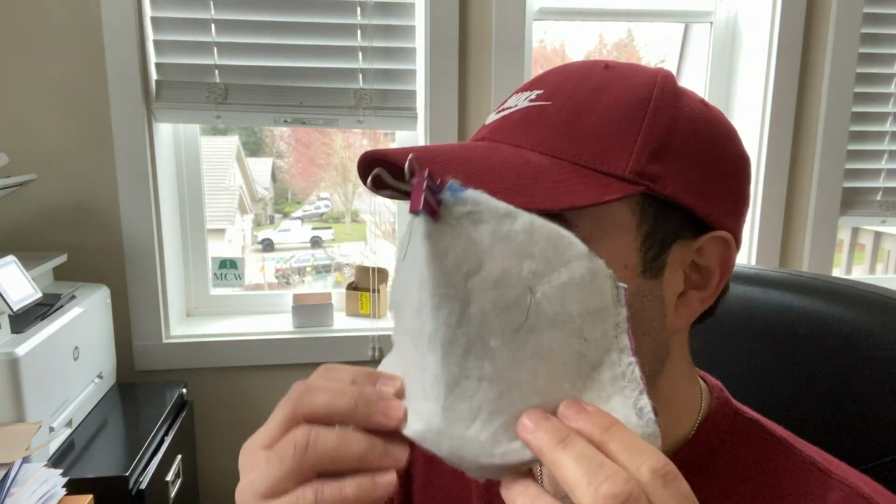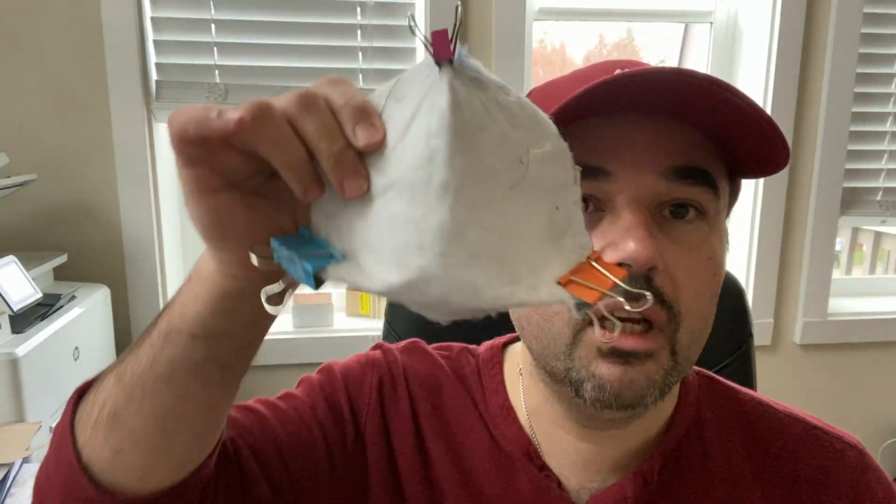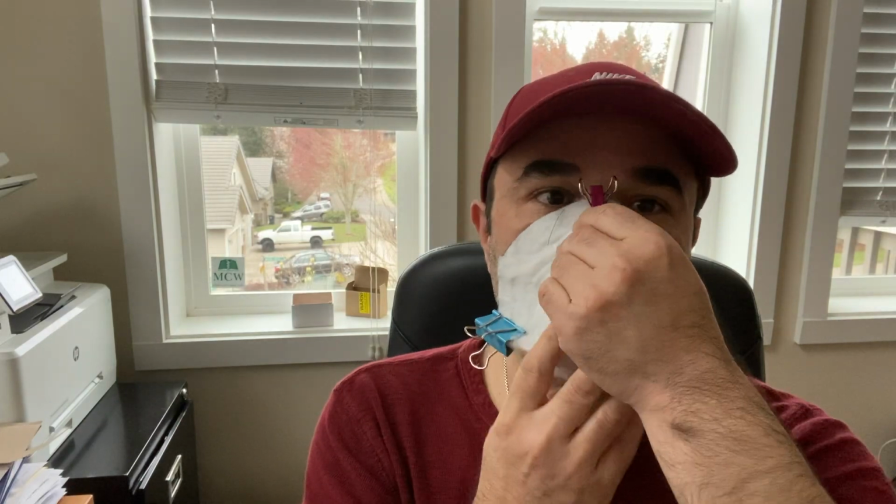So once I've done that, then again, you've got your clips, and I want you to put your clips on there. So now I've got 3 clips on there. Again, dry fit it, and make sure that it's sitting there and not moving. One of the tests is that I want you to open your mouth and make sure that it's not breaking the seal while you're holding it, because the surgical mask is going to hold it against your face. And you should be able to talk and move your jaw easily without breaking a seal.